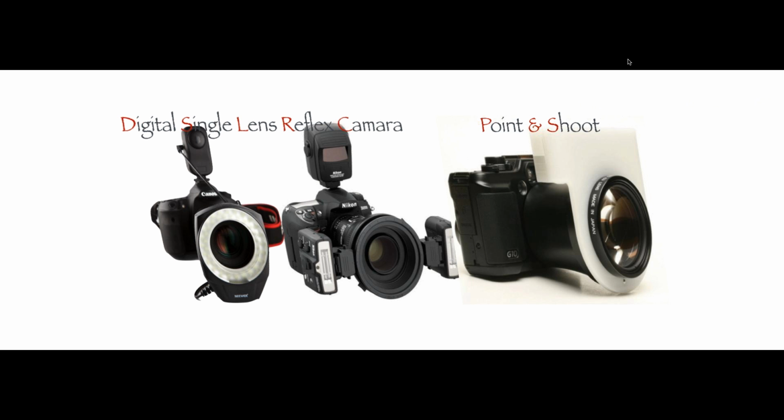Probably they're not going to be as high quality as the ones that I'm going to show you today, because the ones that we do at the school, either me or Dr. Hallock, we actually do using the digital single lens reflex camera, the DSLR cameras. But for many, many years, personally, I don't know about Dr. Hallock, but myself, I used a point and shoot camera for many years before I jumped into the world of DSLR. So I know that they can be used.